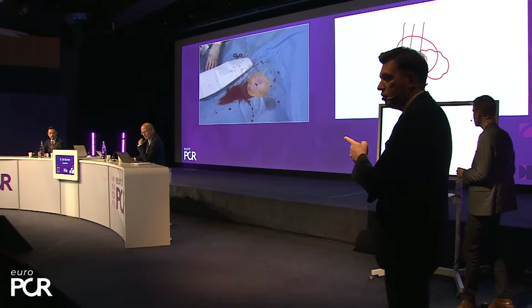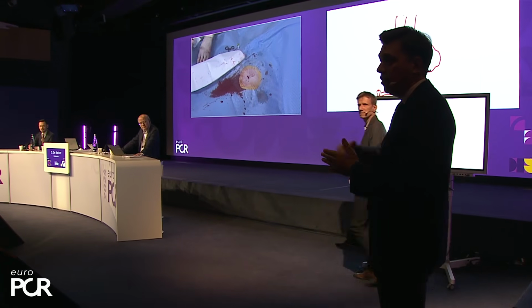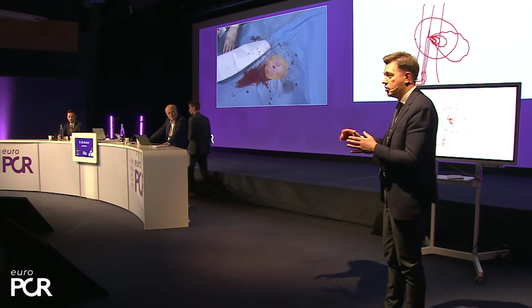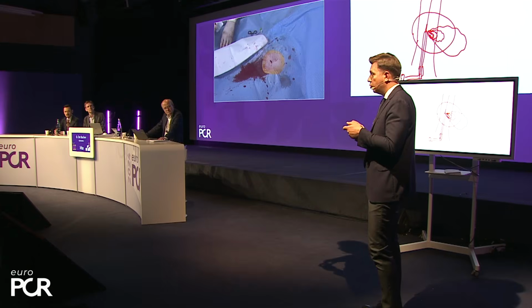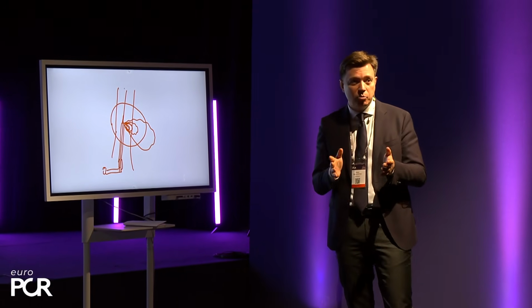I think this was an important point. So basically, there is an intermediate step. You put the sheath in and give an ipsilateral injection to see whether you have any complications, and you close around it on the longer part of the suture. You do not lock in, of course. You lock in once you get everything out. That's an important point, I think.